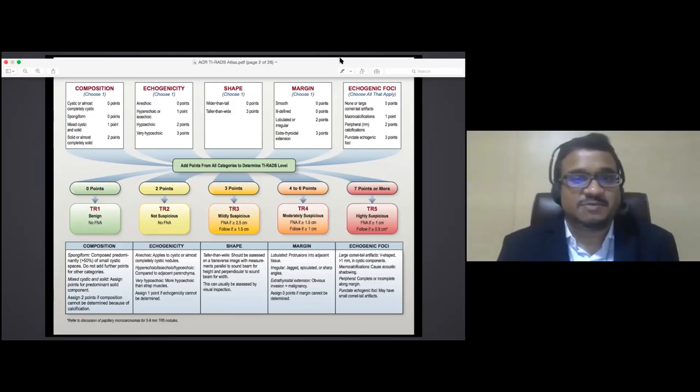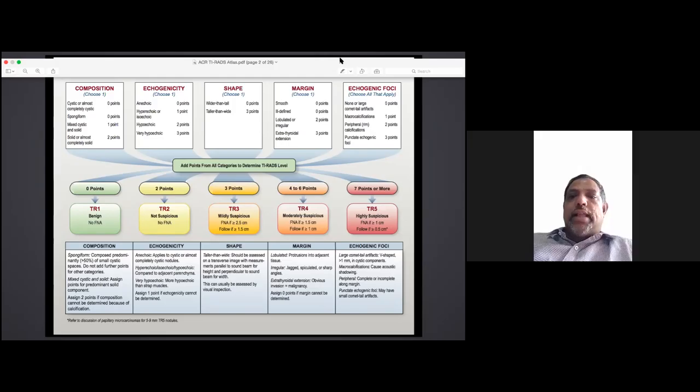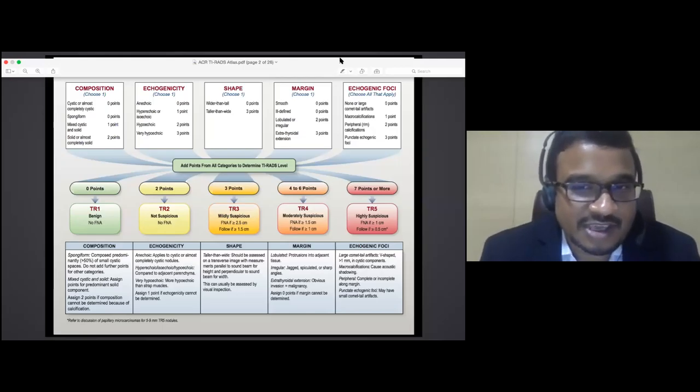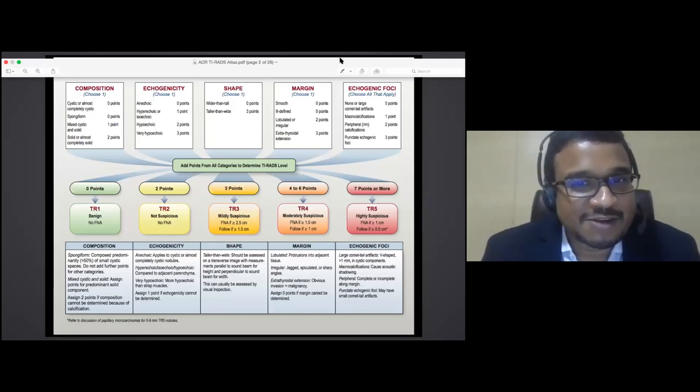Dr. Rakesh Sai, sir, Dr. Shyam, would you like to add anything to this? Rather than adding something, I think I need to go back to medical school again. Here in Idea Clinics, we have an on-site pathologist. When we do the fine needle aspiration, the pathologist is right beside us. The moment I do the FNAC, the pathologist has a look and says whether it is adequate.